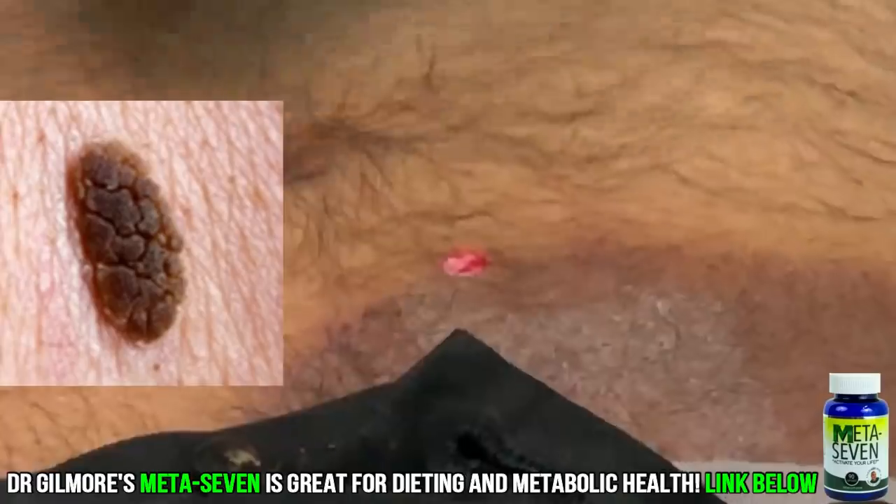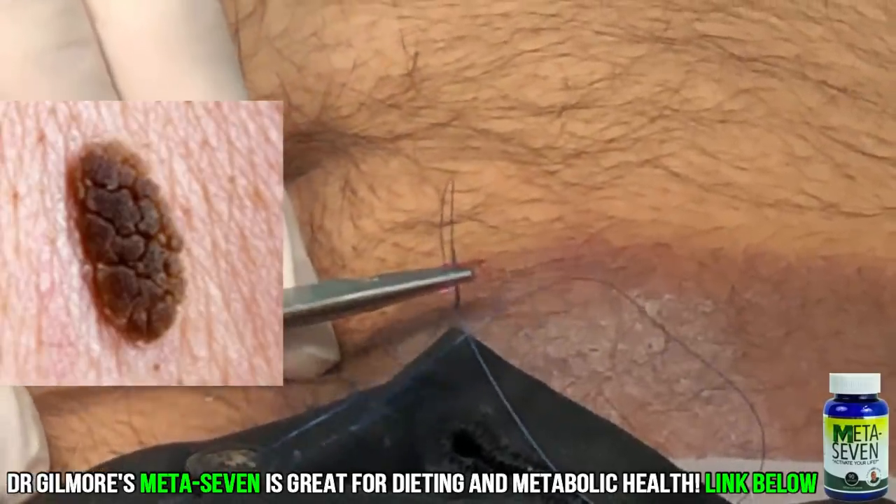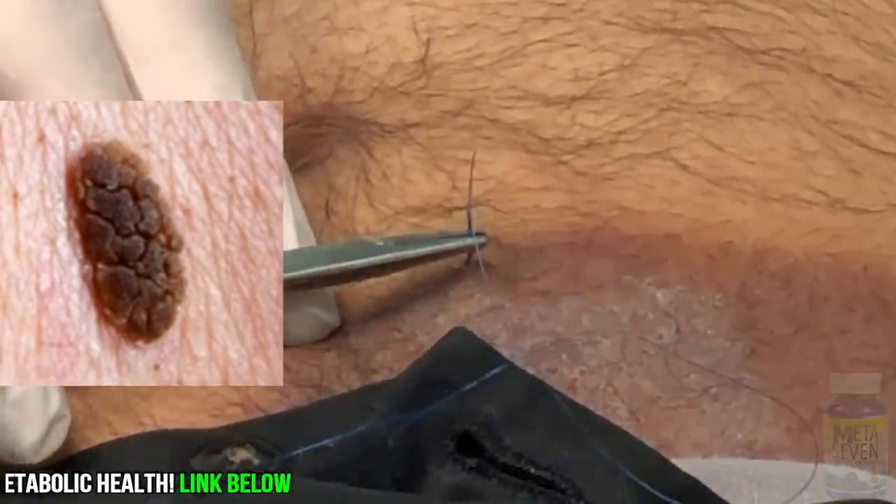Mr. Goose, you still with me? Yes. All right. So this is a little 4-0 Prolene — we'll just stitch that right up.